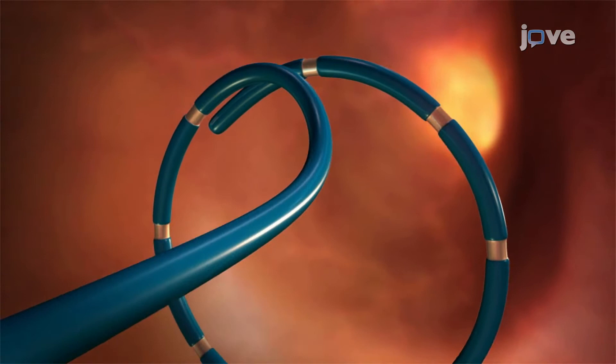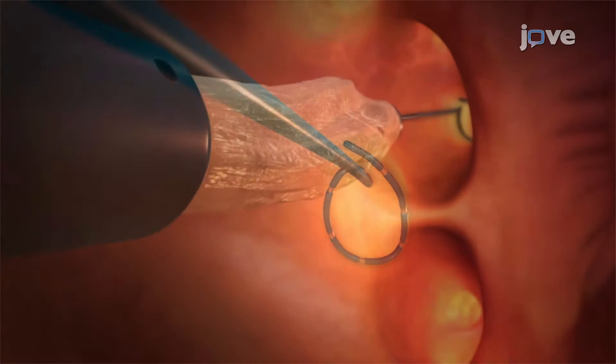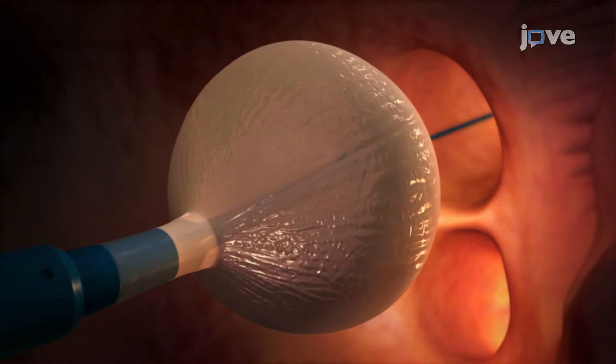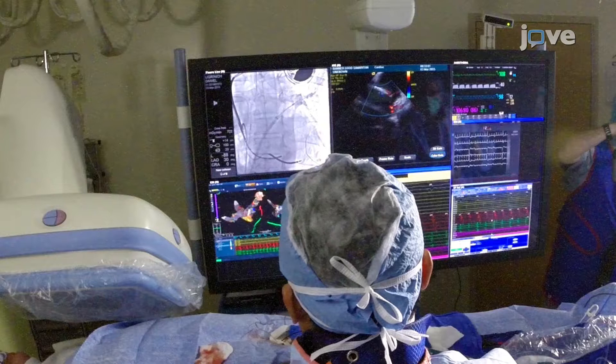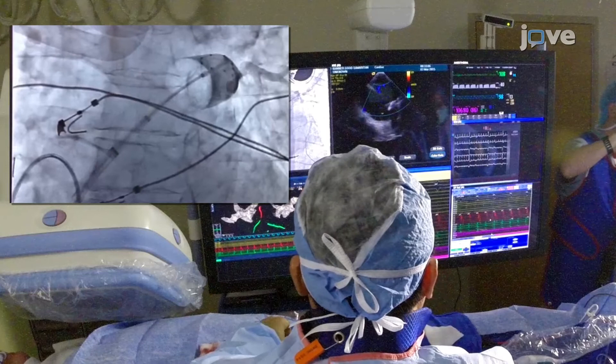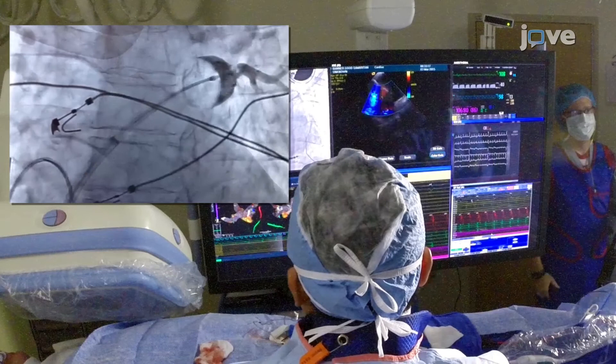Inflate the cryoballoon and advance it over the inner lumen circular mapping catheter, which is wired towards the PV ostium. Inject 5 to 10 milliliters of radiopaque contrast agent through the cryoballoon catheter inner lumen. Confirm cryoballoon to PV occlusion by using the retention of contrast agent after injection at the distal tip of the balloon. Also confirm by ICE imaging under Color Flow Doppler using the lack of flow around the balloon anterior surface as an indicator of occlusion.